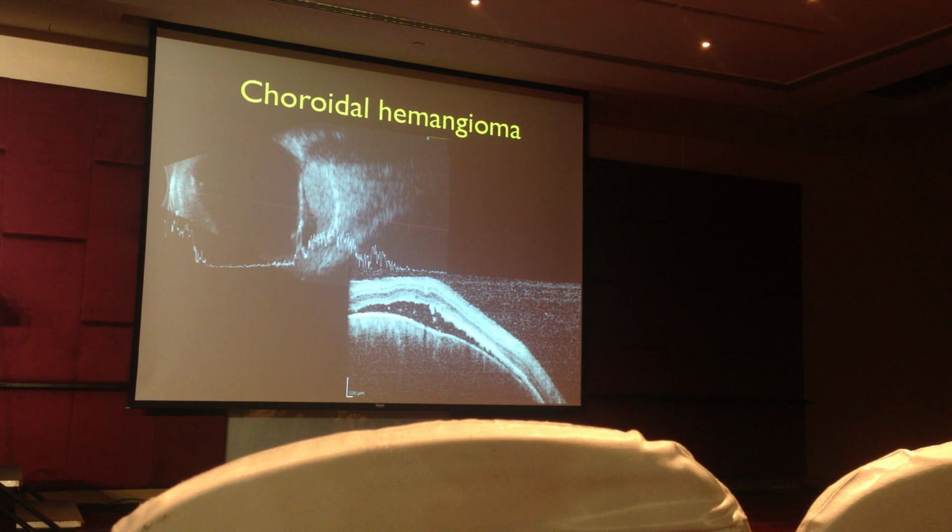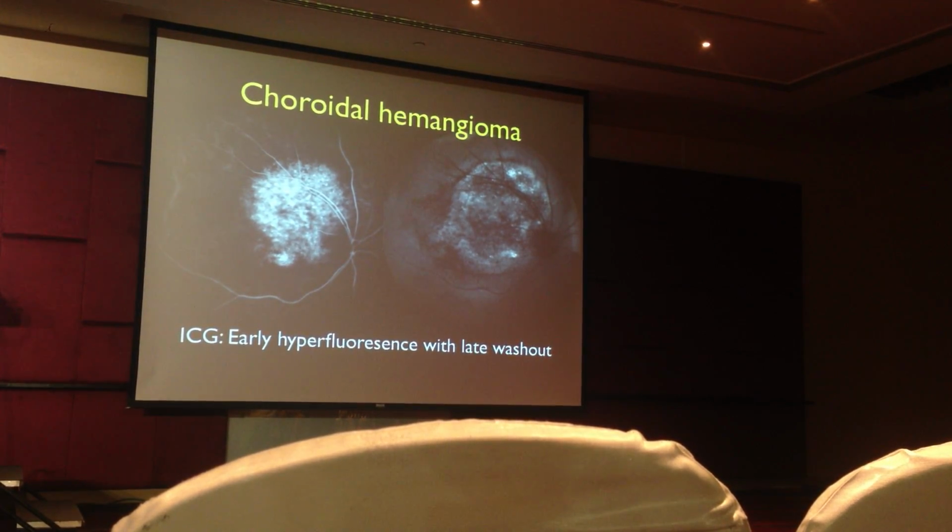On ultrasound, it will show high internal reflectivity, and ICG is a hero in the diagnosis, because this is the only tumor which produces early hyperfluorescence on early ICG and late washout.